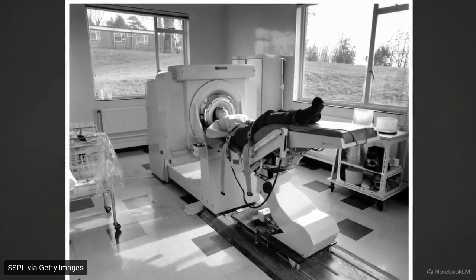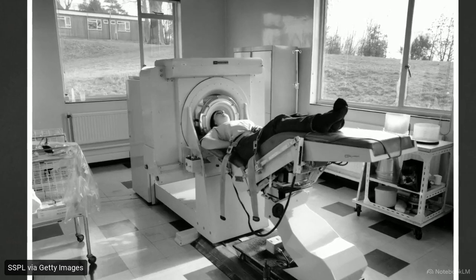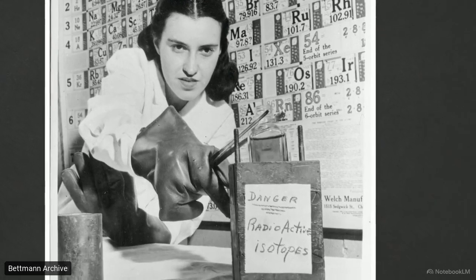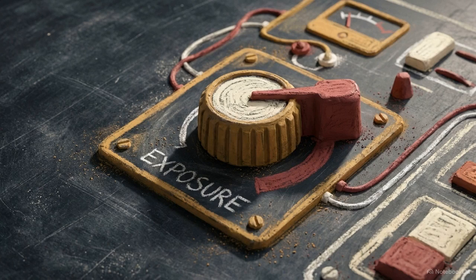Quadrupling the counts translates directly to the patient's physical reality. It requires either leaving them in the scanner for an impossibly long time or injecting a massive dose of the radiopharmaceutical that reaches absolute safety limits. The laws of physics prevent the technologist from simply turning up the exposure to eliminate random noise. Instead, we must accept a noisy baseline.